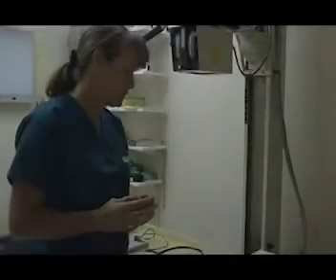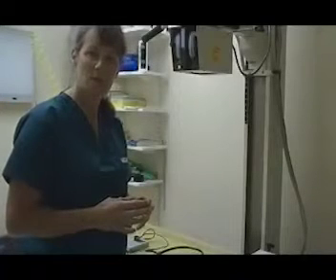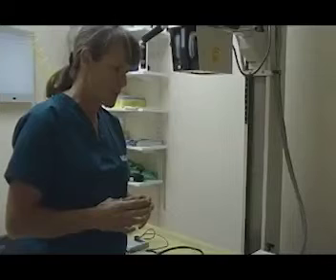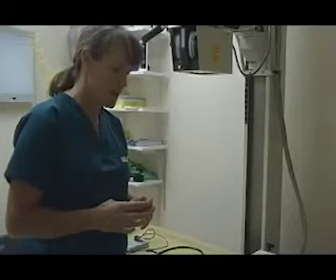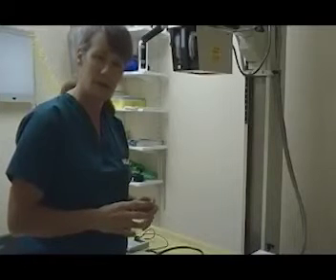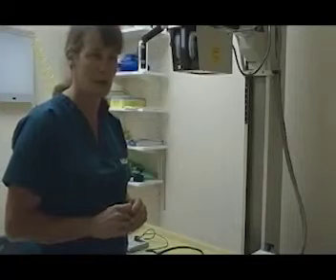What I would like to discuss now is anesthesia monitoring and the use of an anesthesia chart. Let me start first by discussing the vital signs that should be monitored every 5 minutes and those that are normal of a patient that is under anesthesia.